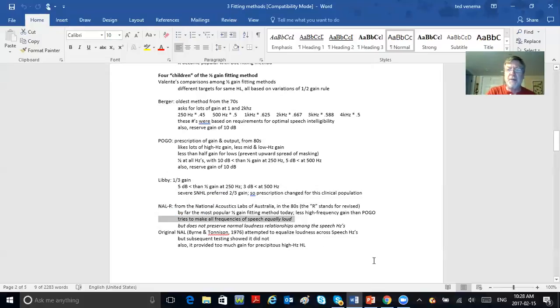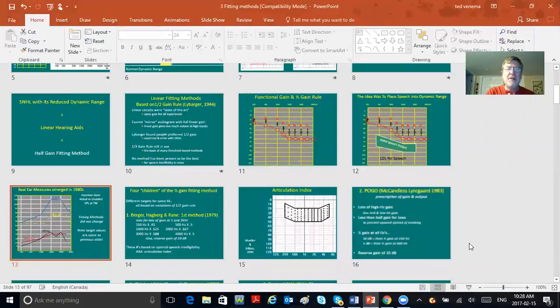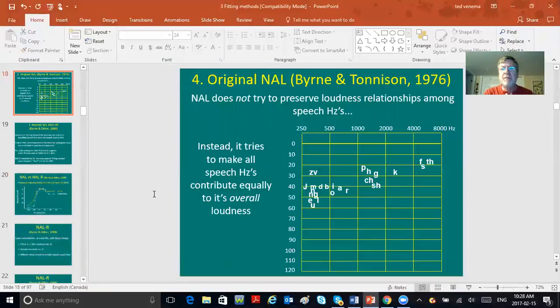What the Sam Hill does that mean? Let's look at this a little bit. Let's look at an audiogram here. Check this out. Here's your speech on an audiogram. We normally hear these sounds louder than these sounds, right? Let's look at this carefully here.